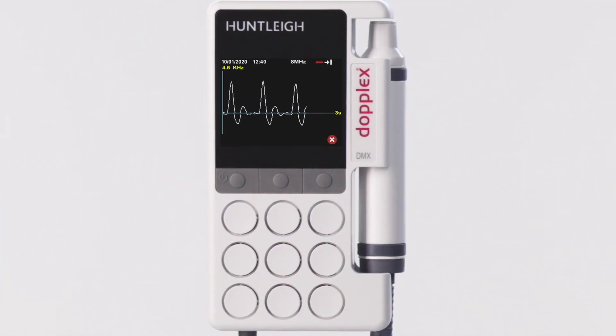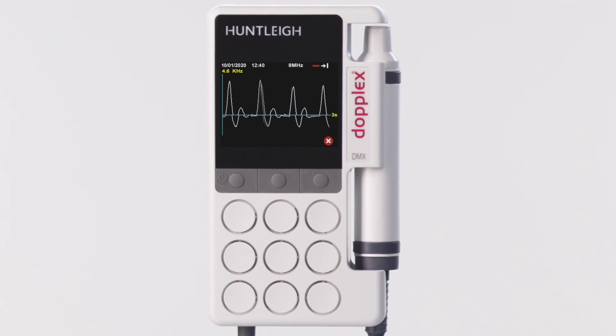The DMX is the best Huntley vascular Doppler ever. Join us now to experience the newest dimension in sound and vision.